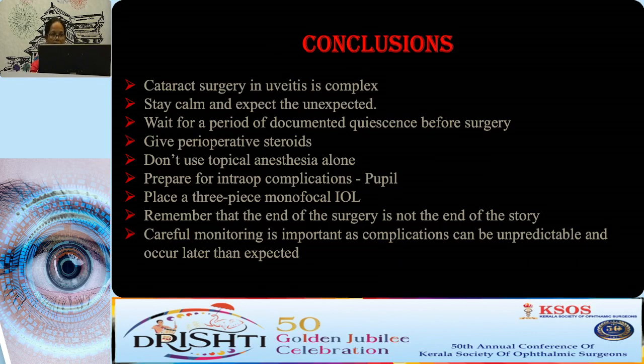Stay calm and expect the unexpected. Wait for a period of documented quiescence of 3 months. Give perioperative steroids. Don't use topical anesthesia alone. Prepare for intraoperative complications. Place a 3-piece monofocal IOL. Remember, the end of the surgery is not the end of the story.